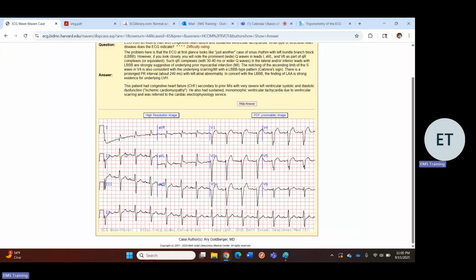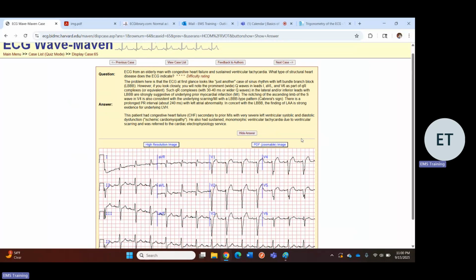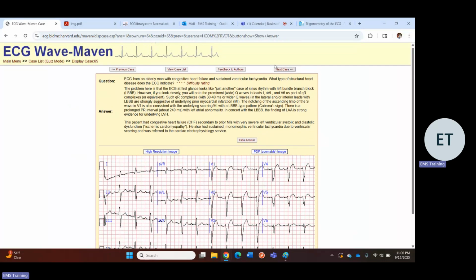Honestly, this doesn't look like VTAC to me. Oh, that's tough. I'll take the loss.